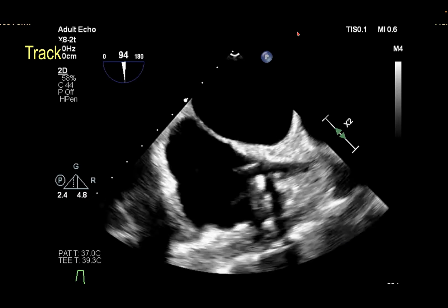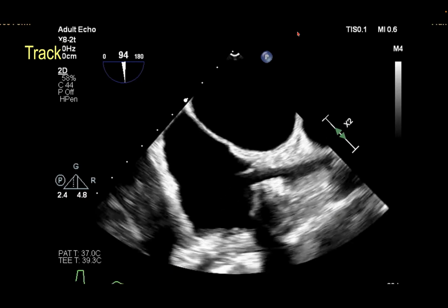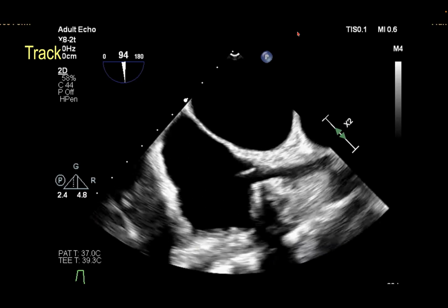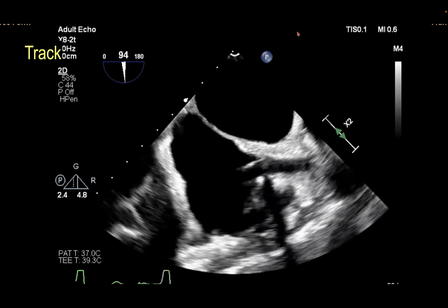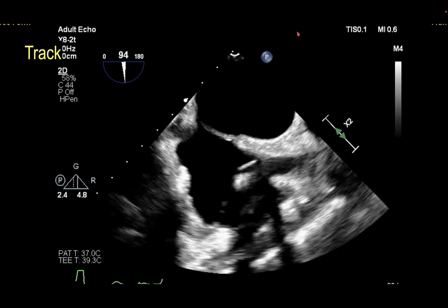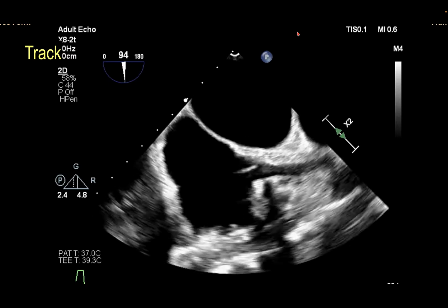This is one of the most complicated parts and requires the most practice. And for us, as you said, it is quite a difficult part of the procedure. What tricks do you have for delineating between the needle tip versus the shaft? How can we determine which is which?